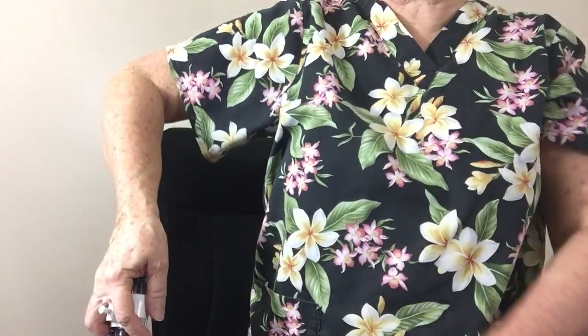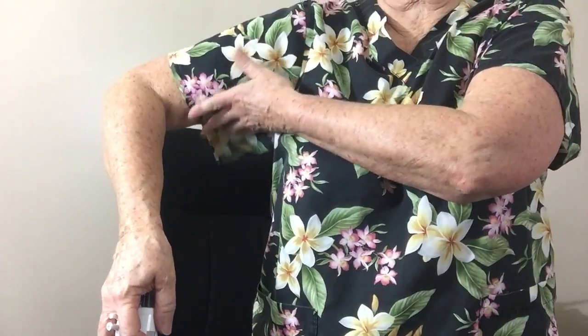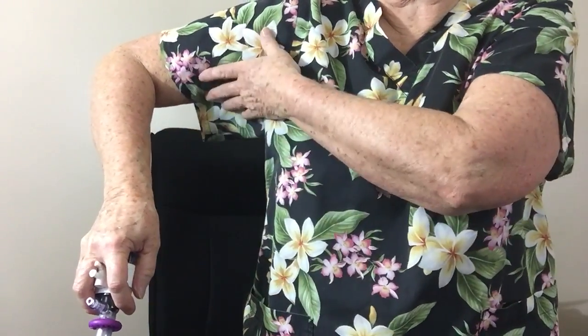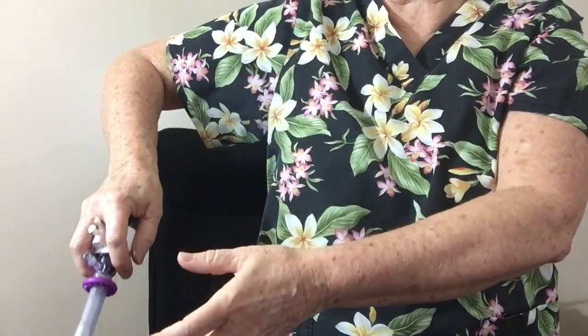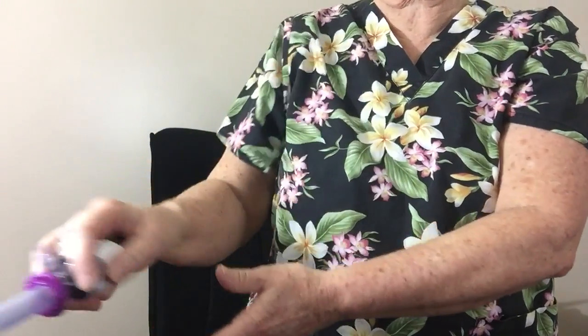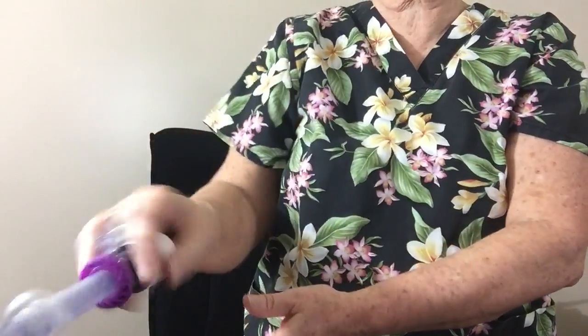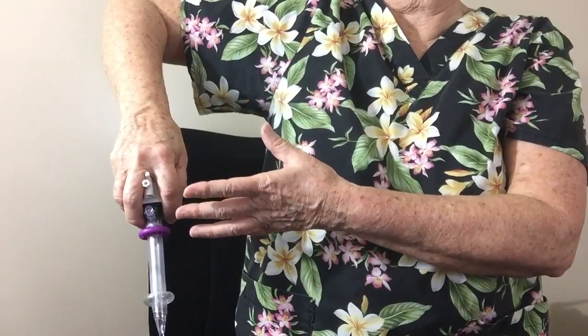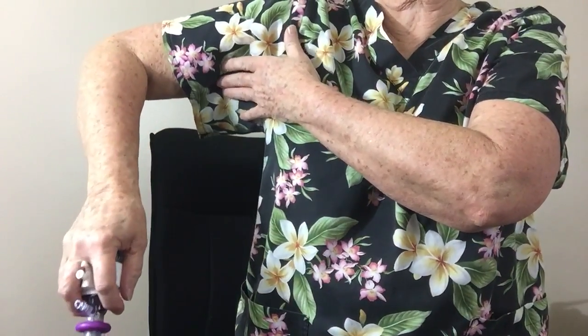You want to be prepared for that pop — you know it's going to give. So you want to have your opposing muscles ready so you have control. What I find I like to do — I'll stand up for a second — I like to have my elbow bent at right angles so that I'm ready to pull back or stop it when it goes through. If I didn't do that, when the pressure is released and it pops through the fascia, my arm would tend to go forward. So I want this position so that when it goes through, I can stop it with this hand and I have control of it.